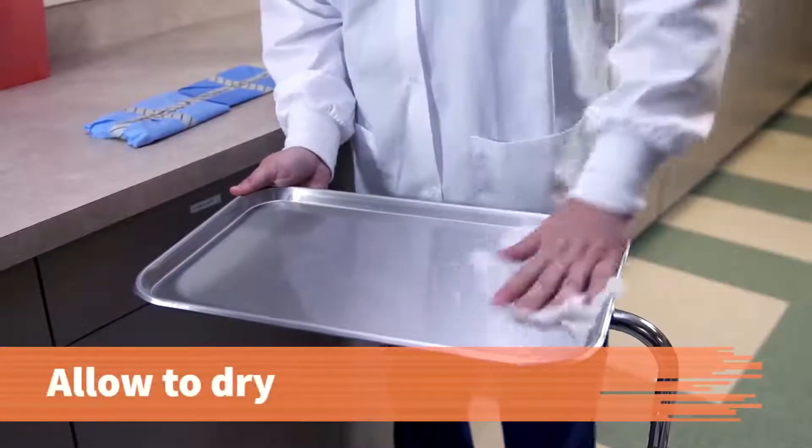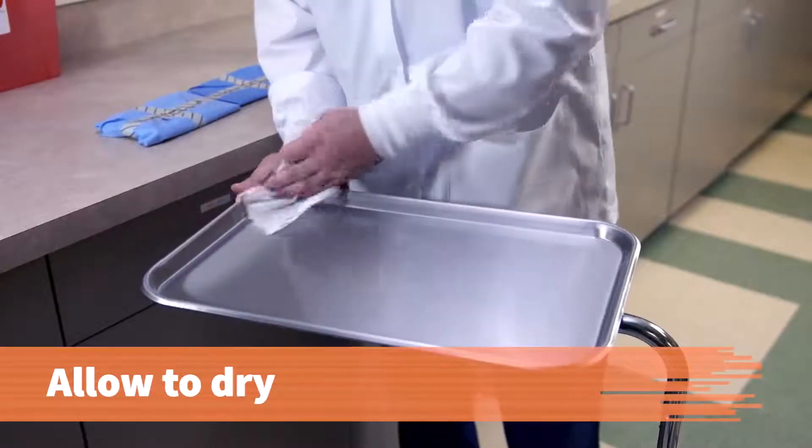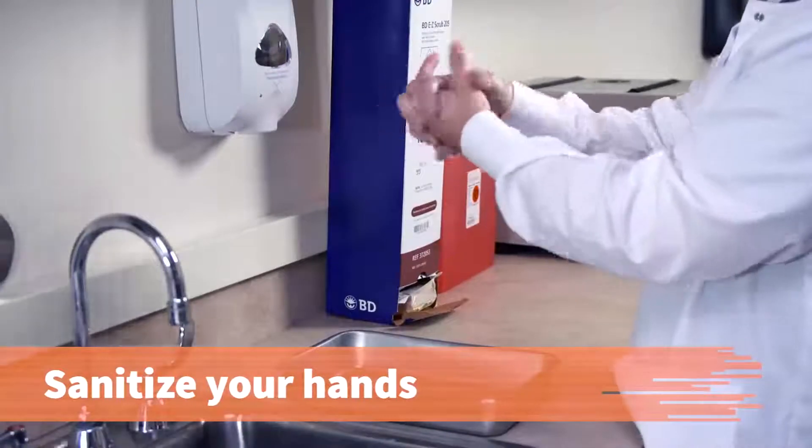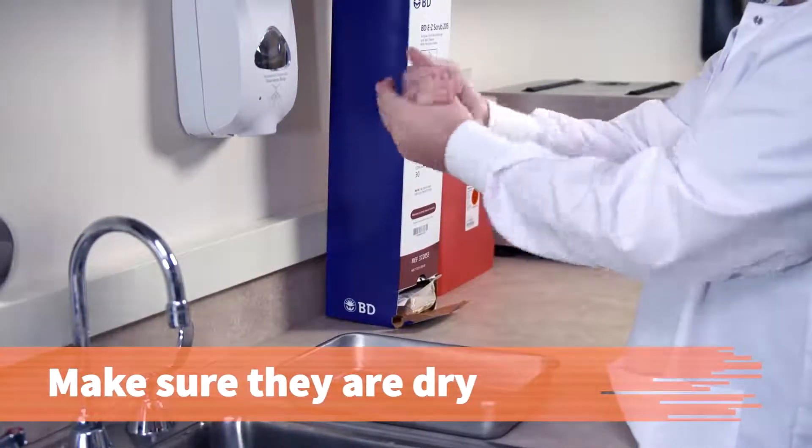Make sure it is entirely dry, as moisture can allow microorganisms to contaminate the pack. Sanitize your hands and make sure they are completely dry. Moisture on your hands can contaminate the pack.